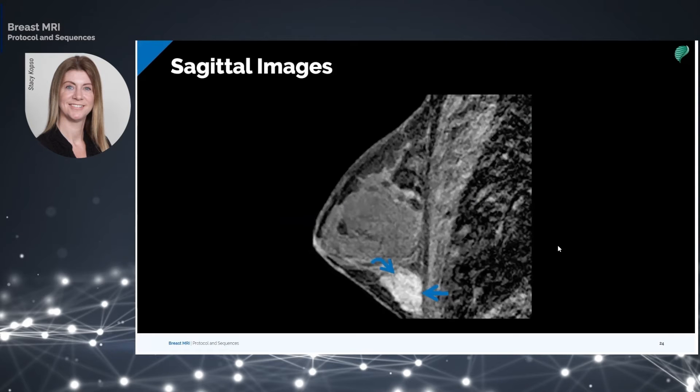Sagittal images are taken of each breast alone because of the large number of slices needed to cover the entire field of view. One stack could require double the number of slices. This also hampers the spatiotemporal resolution.